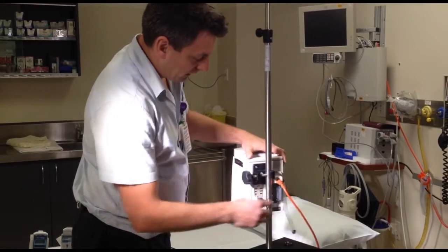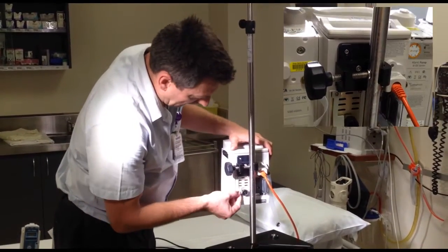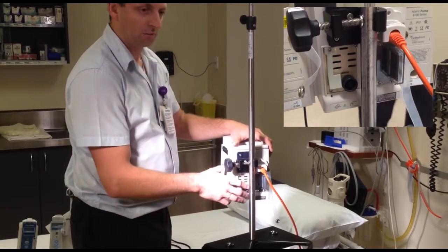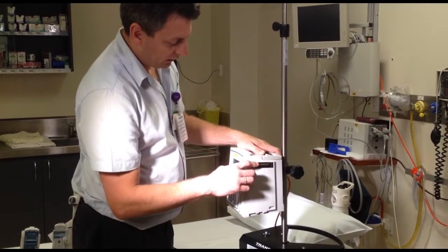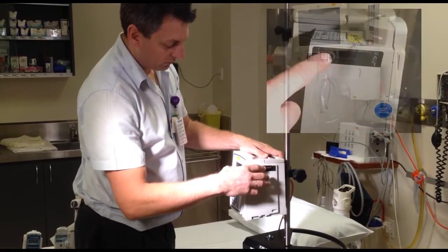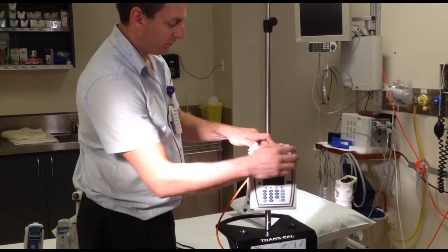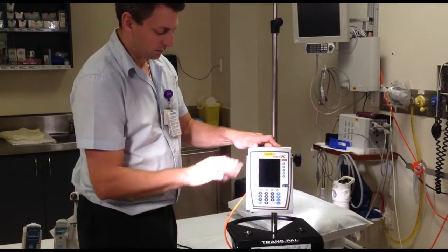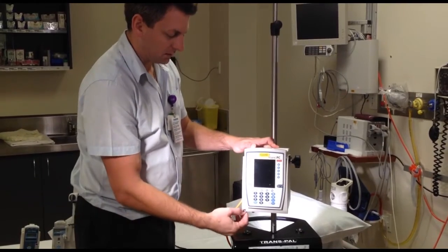On the back you have a power cord, a clamp, an access point for data, and this button here is to lock out the front screen if you need to. On the side you have a connector for the modules and they connect at the top and bottom. One side is a male that sticks out, the other side is a female that gets pushed in, and down the bottom here we have a releasing mechanism.